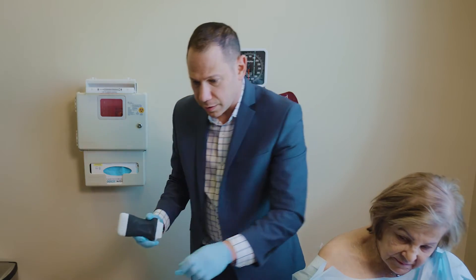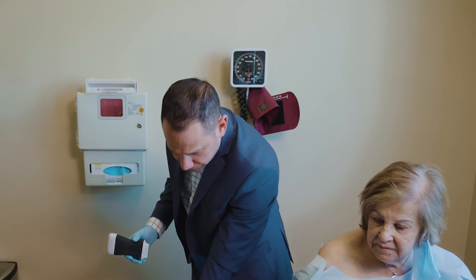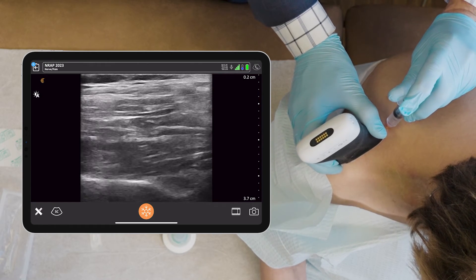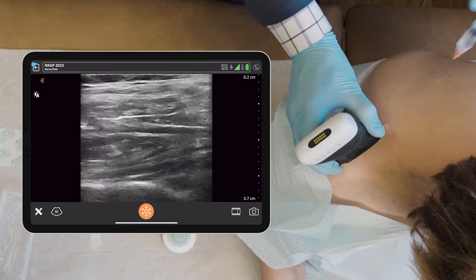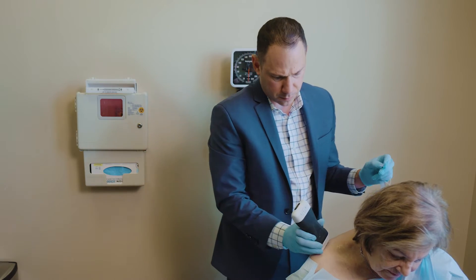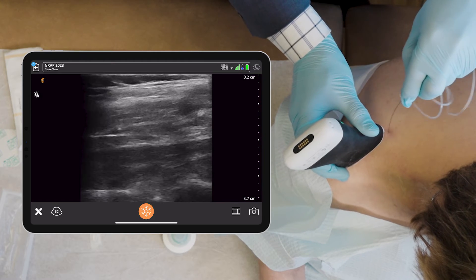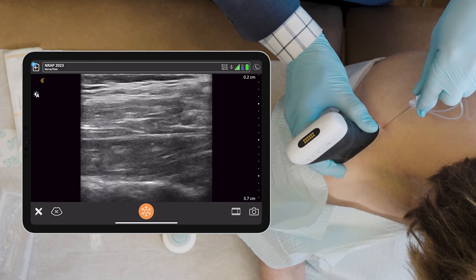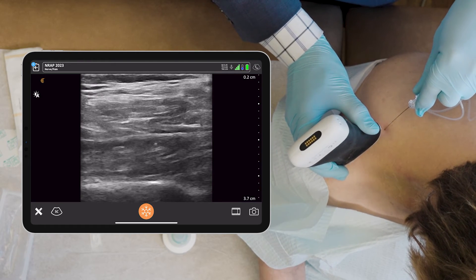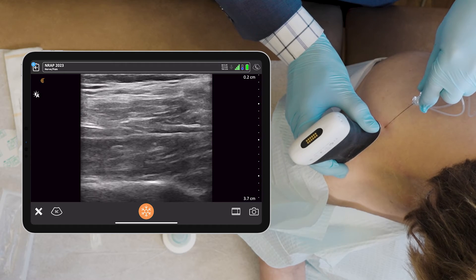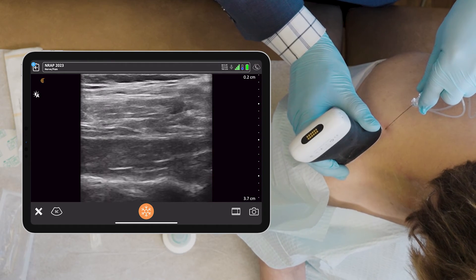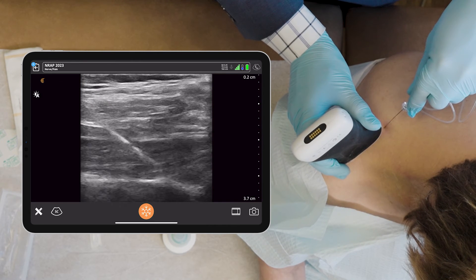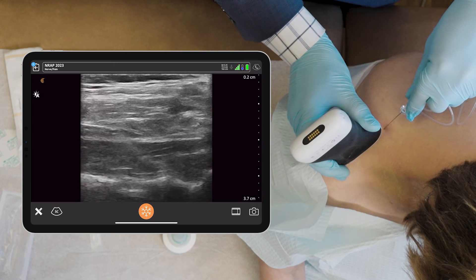Now I'm going to perform a suprascapular nerve block. First I'm going to localize the skin. You may feel some pain in the shoulder right now.